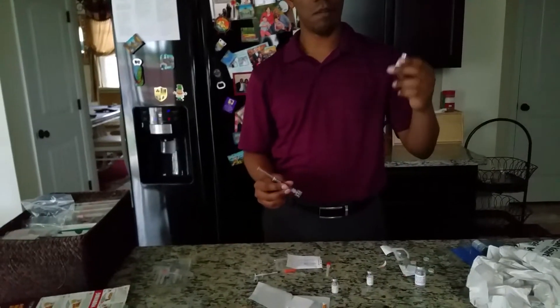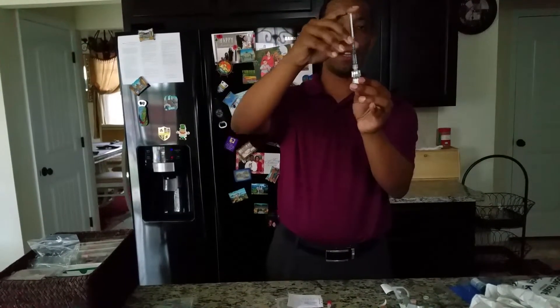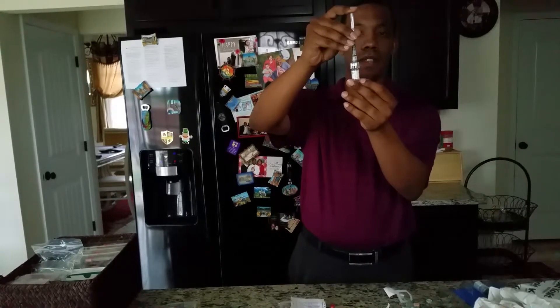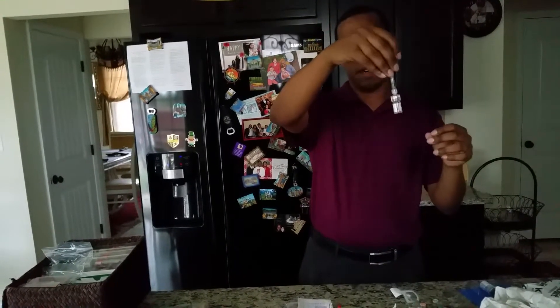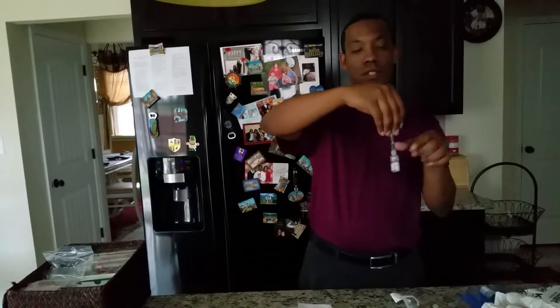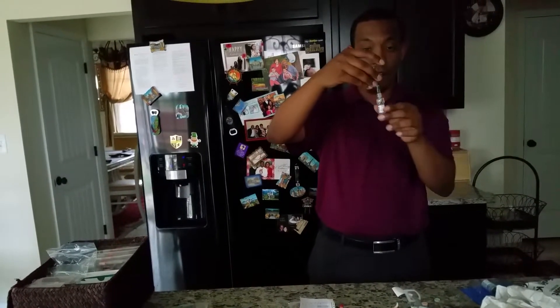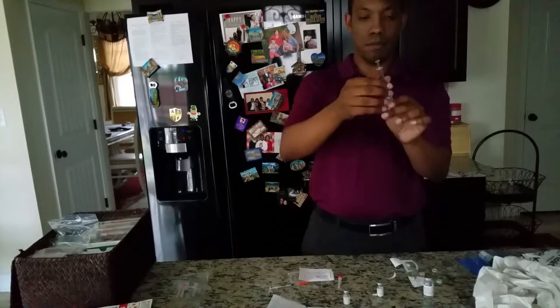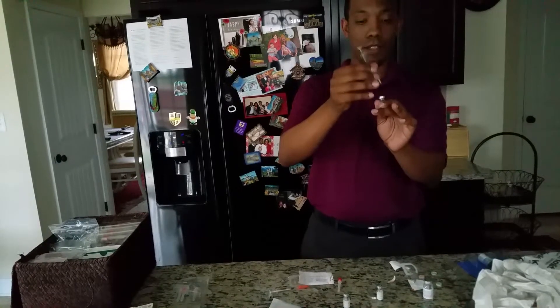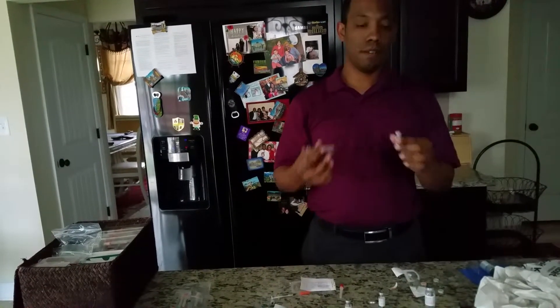I'm going to take my Menopur, cover that up, and inject the whole thing inside there. That dilution will get onto that powder — swish it around, swish, swish. Not up and down. The reason we have to do this right now is because the Menopur and the Gonal-F have to be used within 30 minutes of being mixed.